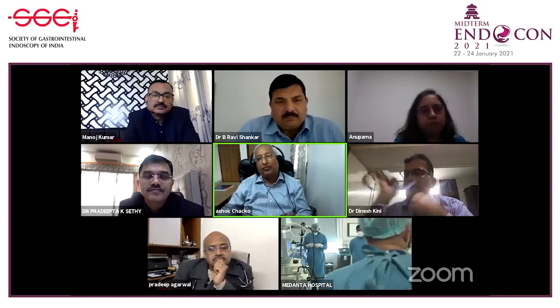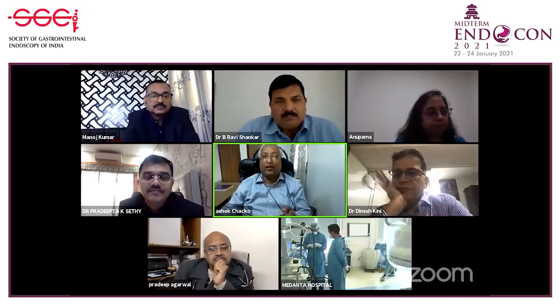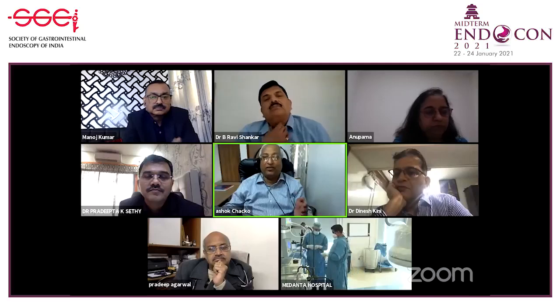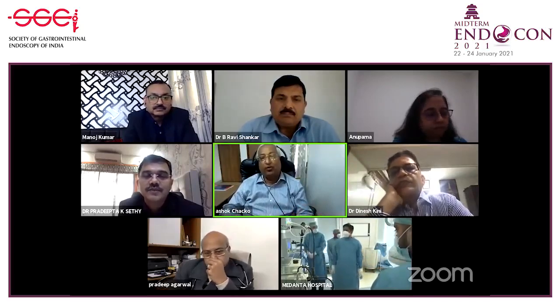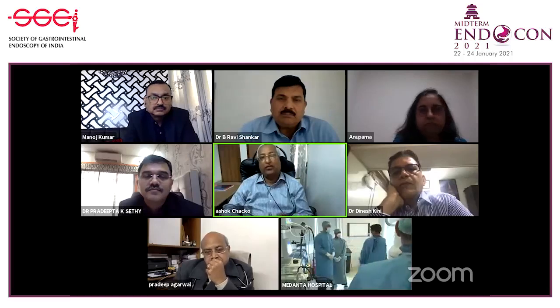It had been 1 week, 10 days, and the capsule hadn't come. So we were worried. But now we have enough experience, not only us, to show that we don't have to rush in. We can wait. Even the definition of retention is that a capsule is there for more than 2 weeks. And even for long durations, even years, a capsule has been retained in a patient in the US where no complication has happened. So there's no need to get worried. And now we have balloon-assisted enteroscopies and spiral with which you can take it out. You don't need to go in for surgery.